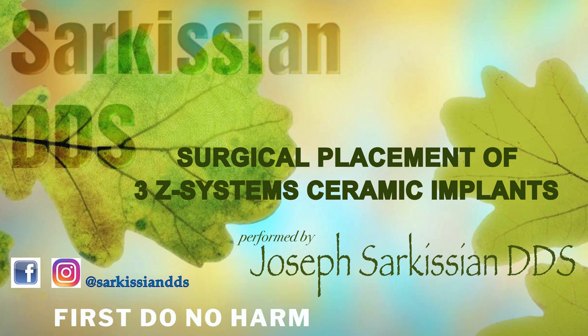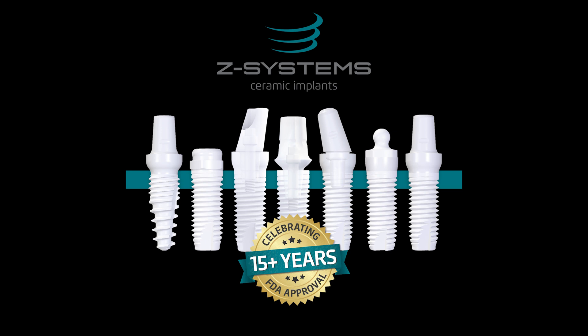Zirconia is a fully metal-free ceramic and the company offers multiple options to fit your needs, including one-piece, two-piece gum level, and two-piece bone level systems.